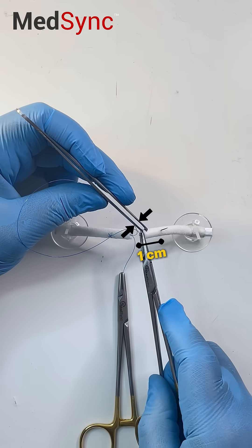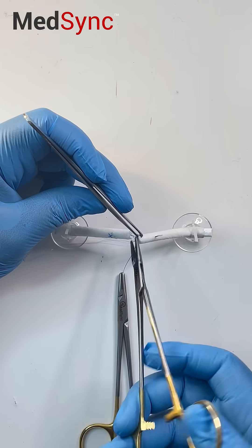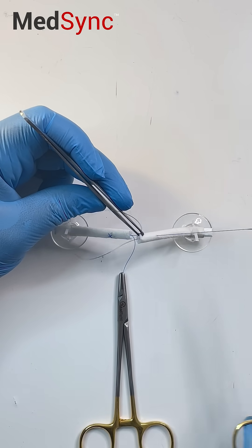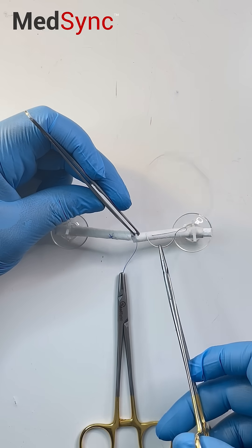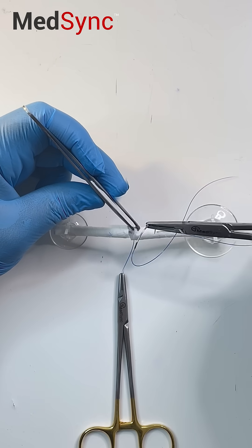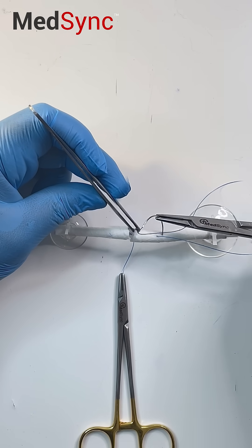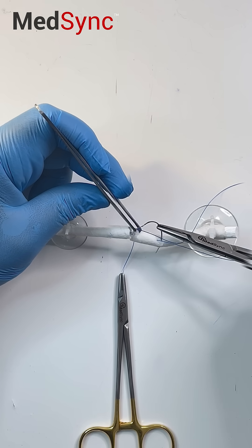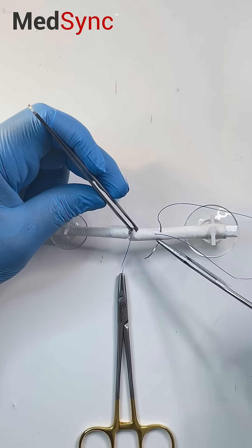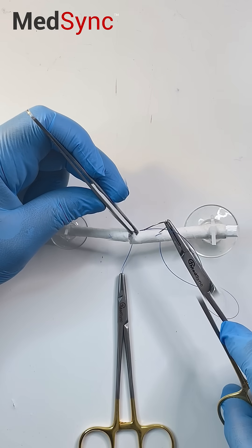Hold the tendon, don't let go until you've completed the repair. Gently feed the needle through and rotate your wrist — we're going to twist the needle round. Take a transverse bite distal to the first, but you stitch towards yourself. It's a round bodied needle so follow the curve. Twist the curve, mount it straight away and complete the cross.